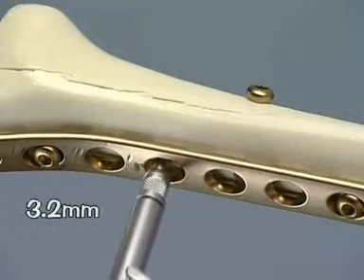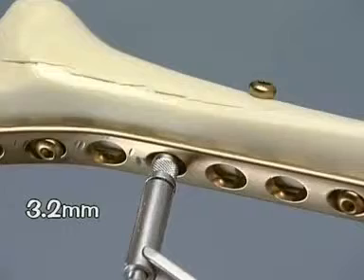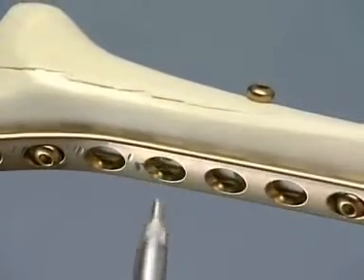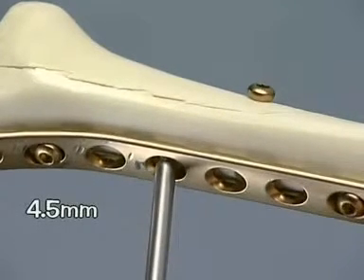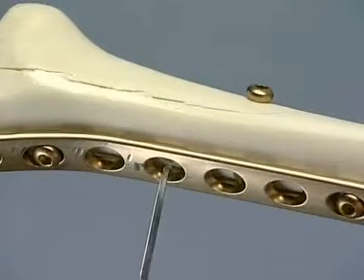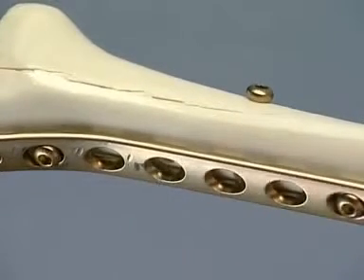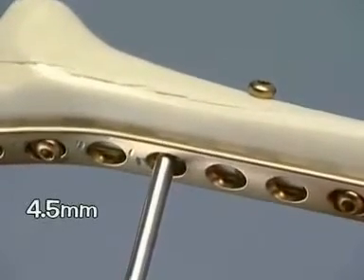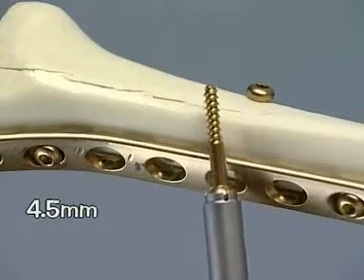To this end, drill a 3.2 mm hole in the neutral position into the opposite cortex. Then drill the gliding hole in the cortex nearest the plate using the 4.5 mm drill bit. Measure the depth. Tap. And insert the 4.5 mm shaft screw.